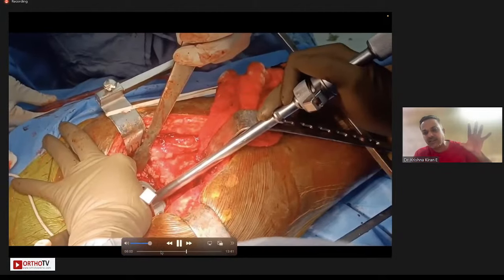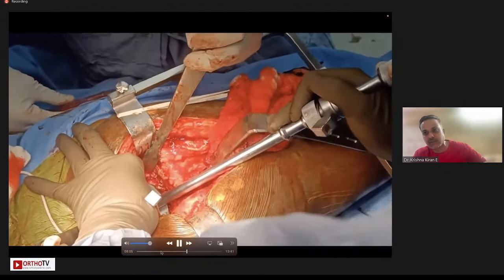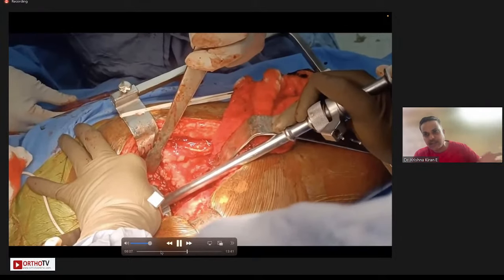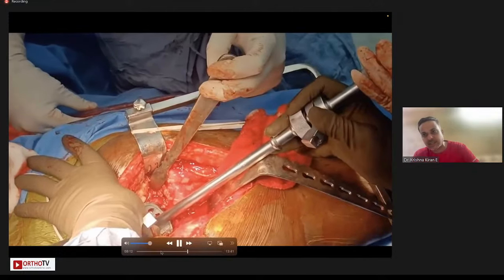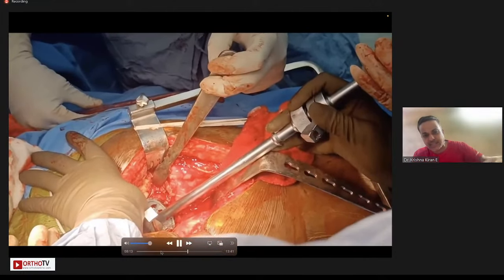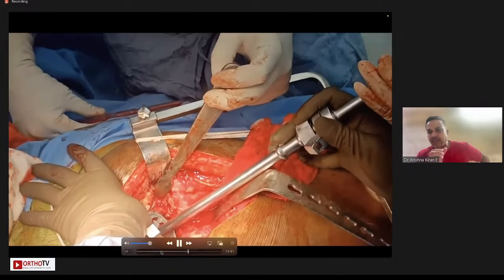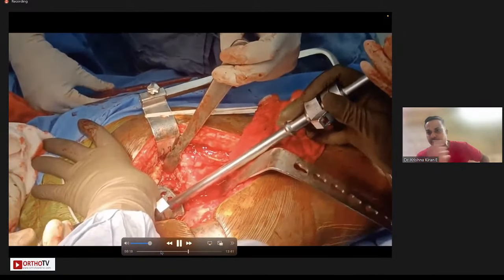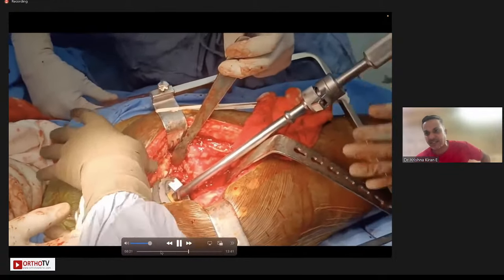What we have done, we have converted an uncontained defect into a contained defect, put a couple of screws into the augment, stabilize the augment, stabilize the cup between the augment and the remaining acetabulum using cement between these two, so that now you have a toggle point. So when you try and push the cup inferiorly, it will not pull out into adduction. It will not fail in adduction.